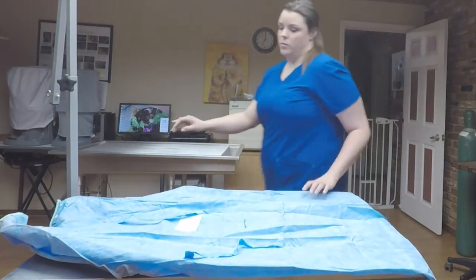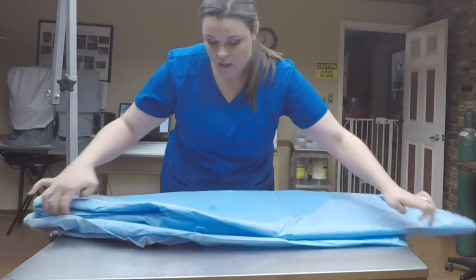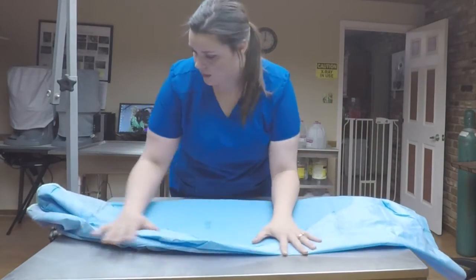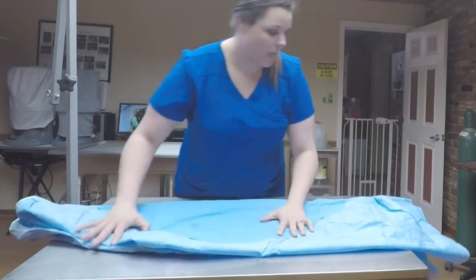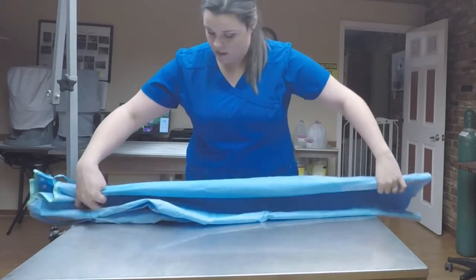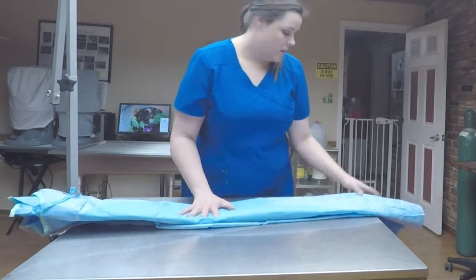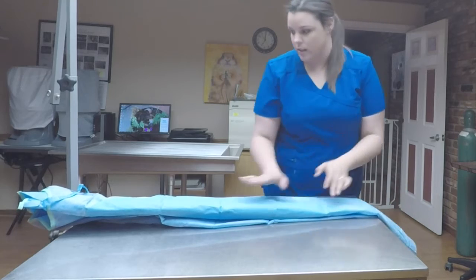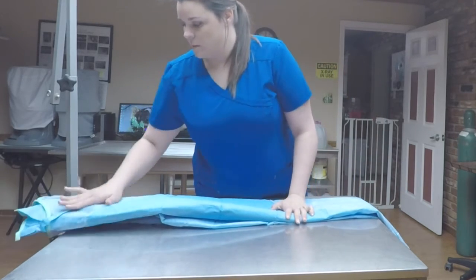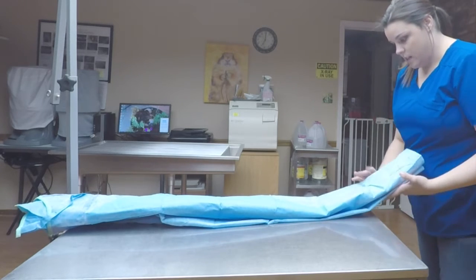Okay, and then you're going to want to fold the whole thing in half, like so. And then one more time, fold it in half. Then you are going to want to fold it like you do your instrument packs in the accordion style fold.